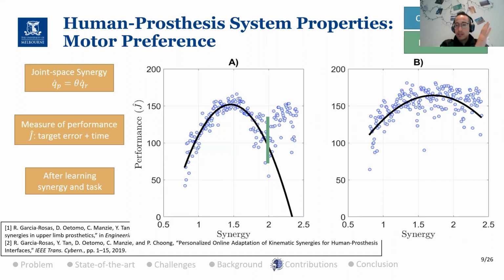So we did a sweep of all these parameters, and these are two different people. Even though we obviously have a lot of variation in the measurements, which is expected from people, this is as good as it gets with getting this sort of relationship in humans. We got the shape that we want.